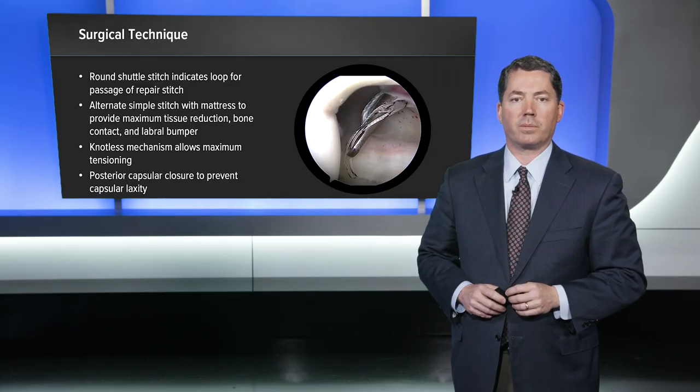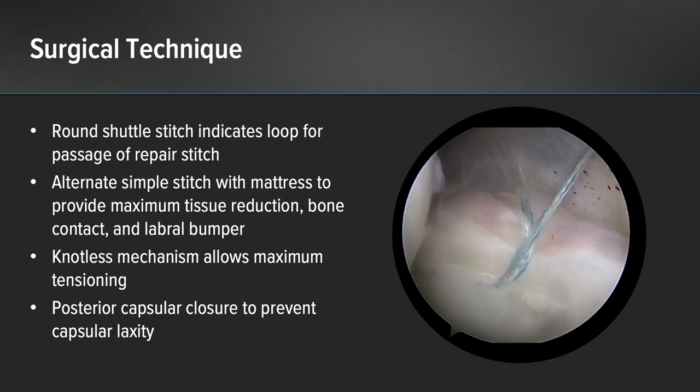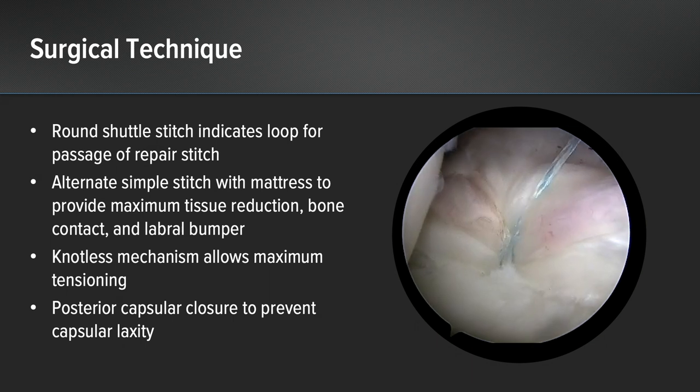This knotless mechanism allows maximum tensioning — you can put as much tension as the tissue can tolerate. For an older patient population with worse tissue quality we pull in the suture less and do less tension. For these young athletes, like this 22-year-old gymnast, we're able to put a lot of tension on the labrum and really get a good labral reduction.